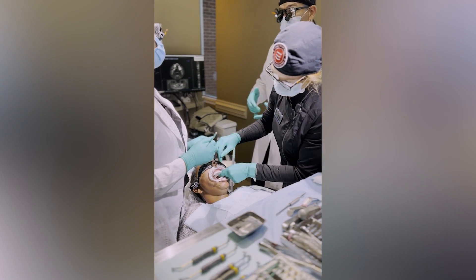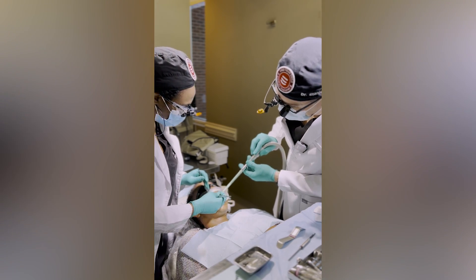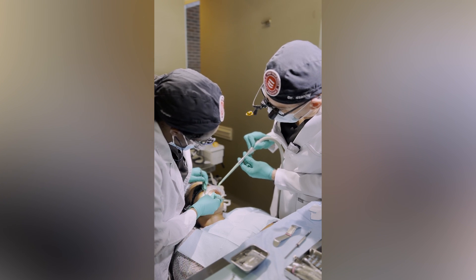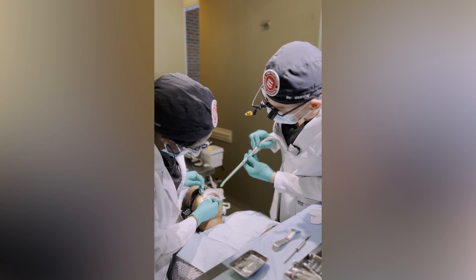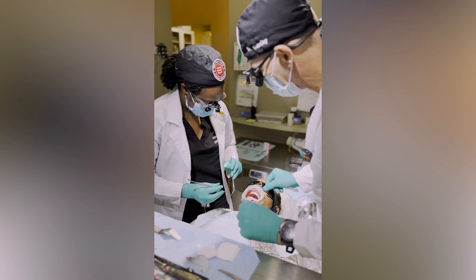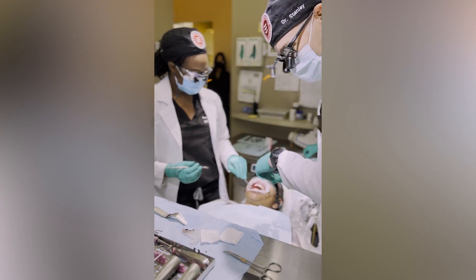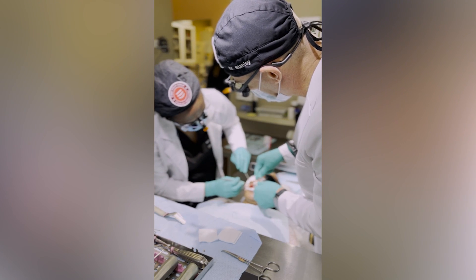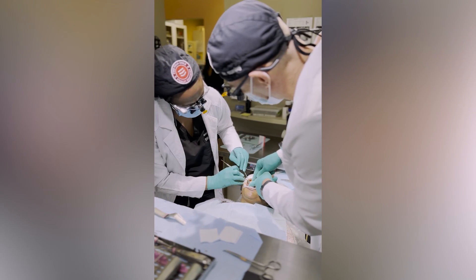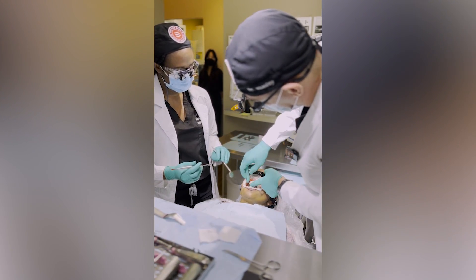Now that we know that fits, we have to do that slightly palatal. You're on the bone with the beaver tail — just walk it backwards. This is the bottom coming loose; if it comes loose, we have another one we can put in there. These things have a tendency to kind of pop. So while you're holding it back with the beaver tail, I'll just slightly insert this, and then it will be held out of the way. Verify that it's seated all the way, and you're good to go.